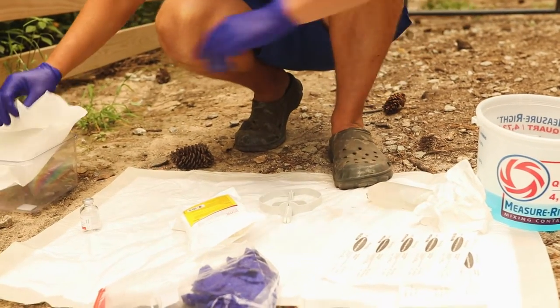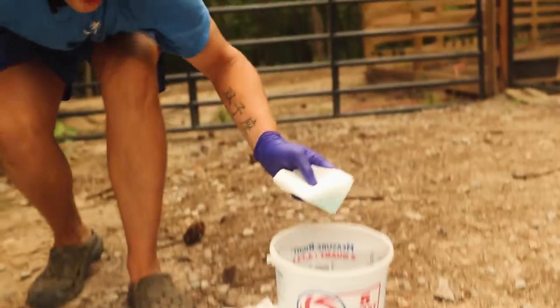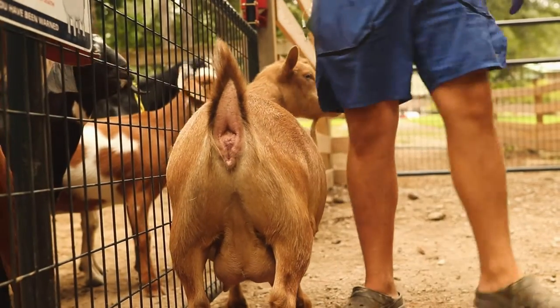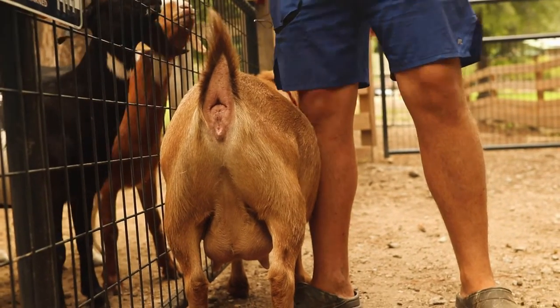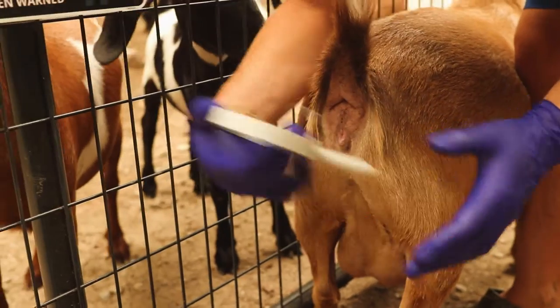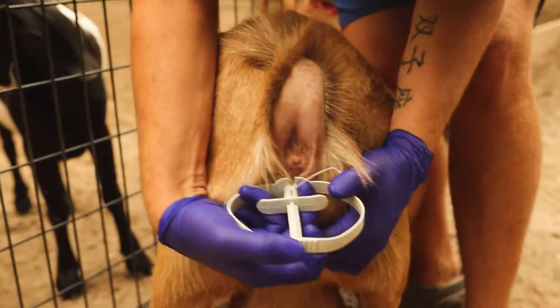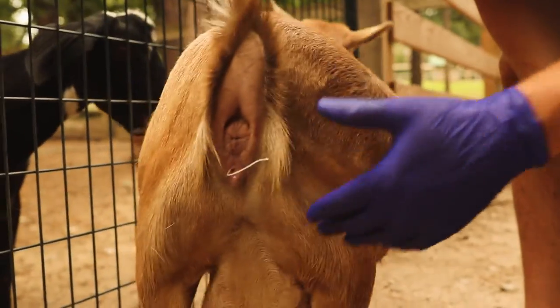So now the CIDR is loaded and ready to go. We need to go ahead and clean the goat. I'm going to get a paper towel, dip it in a little bit of chlorhexidine, and wipe off the outside — just any debris or dirt or anything. Then we're ready to go ahead and implant the CIDR. As a dairy farmer, you're very used to working around a goat's backside. We know that just inside that opening there is actually going to be a pelvic bone, so you'll go straight in and then angle it upward a little bit, go up and over that to leave the applicator before you pull it out. And now you can see there that little bit is left out, and what we'll do is in 14 days, use that part to actually pull the CIDR out.